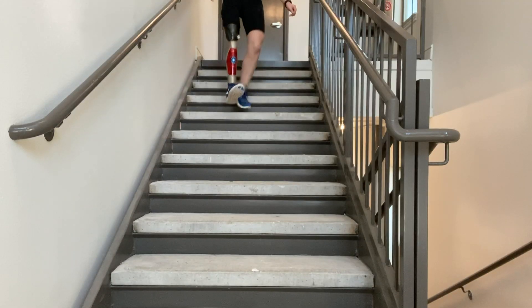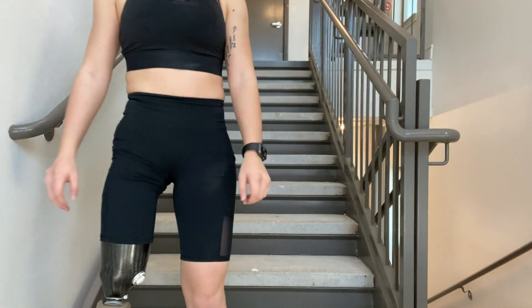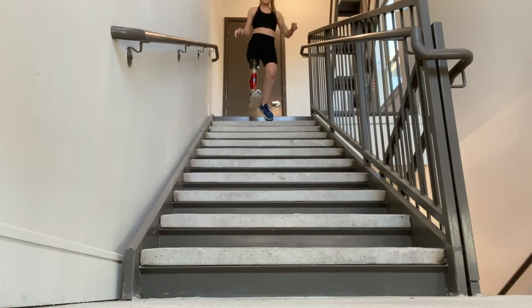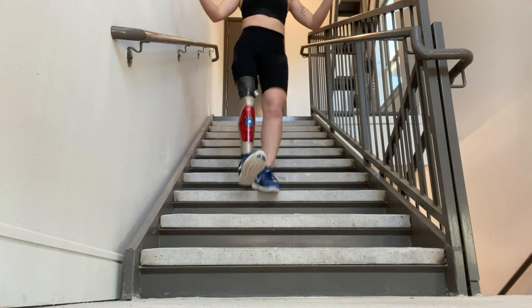So going downstairs, I kind of had to learn my own way of doing things, which you'll see in these clips. The way I always went downstairs before I got my C-Leg was that I would hop on one foot and just take it all the way down. It can be super dangerous sometimes, so don't try this at home, kids. But it's just what I learned to do — it's the fastest way to get down the stairs, and it worked for a really long time.